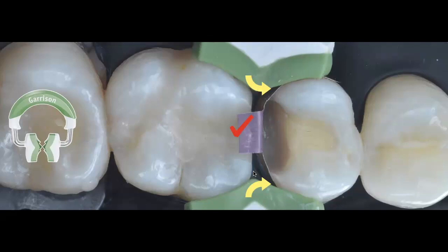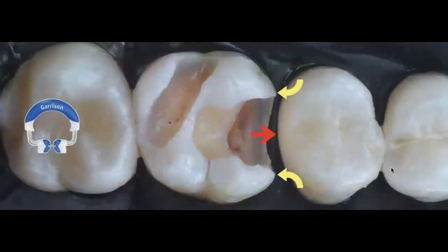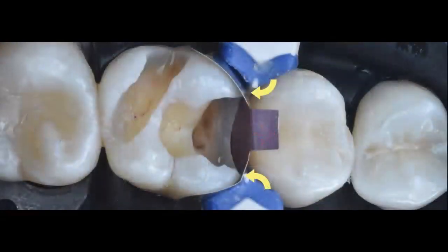So those are the things that as a clinician you should be thinking of when you're confronted with cases like this. So you can see now I'm building the proximal wall of tooth number 13. And once I'm done restoring tooth number 13, I'm going to remove that Garrison ring. I'm going to prep the neighboring tooth. I'm going to place my band and select a different type of ring.